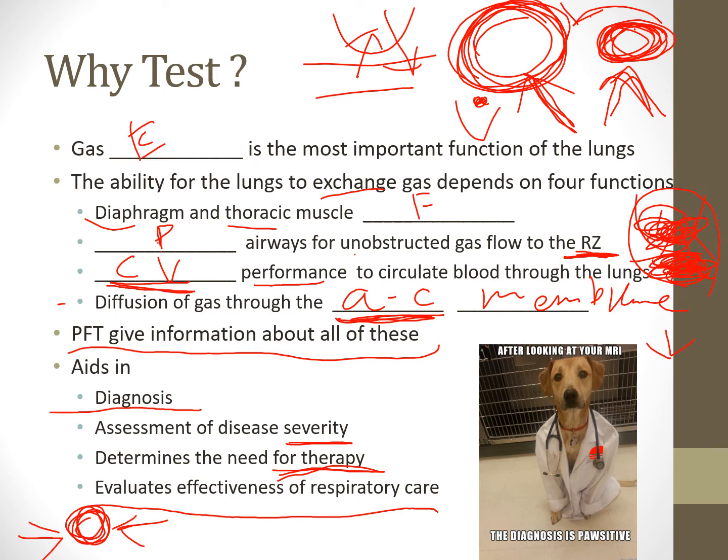And so now they transition from there over here to where now their lumen's much bigger. Well, if I checked a peak flow rate over here and it was very low, and then I checked a peak flow rate 10-15 minutes after I administered albuterol or a bronchodilator, and I see the flow rate has actually increased, then I've actually seen how effective that therapy is, right? We can actually see the change and measure it and say, hey, that change is greater than 12%. That patient responded really well to that therapy, right?